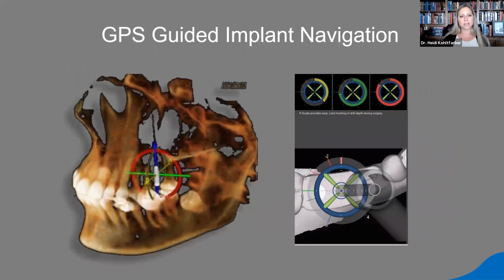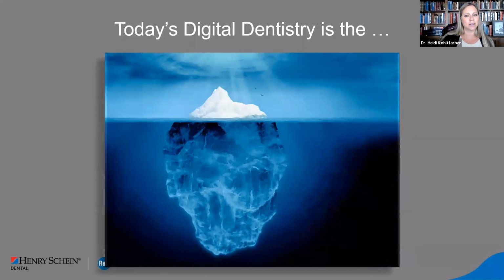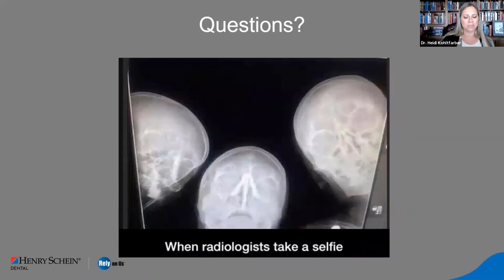And of course, there is GPS guided implant navigation. So if you want to go even beyond, we can use your CBCT and work with an implant guided navigation system. So really, today's digital dentistry is just the tip of the iceberg. And there's so many places that you can go.